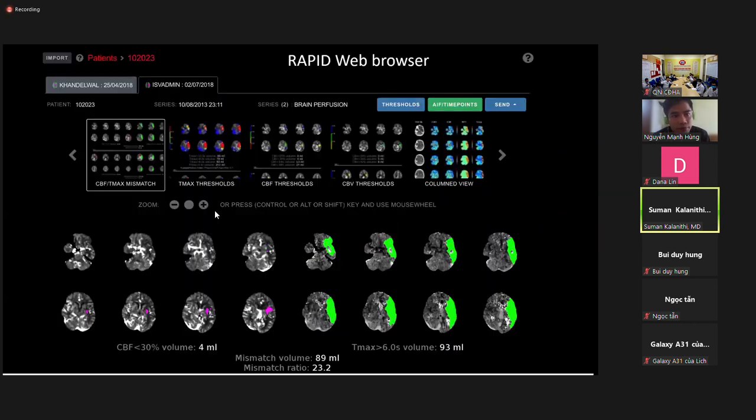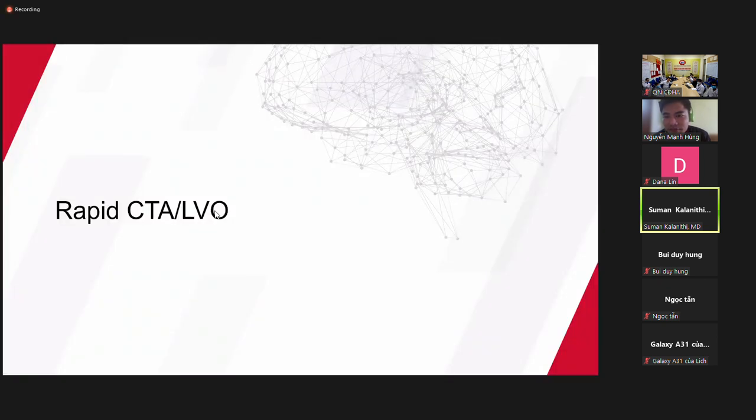That's actually basically it. I just wanted to show you some of the things that can be confusing about Rapid, but they're not that many, and you guys are very smart and sophisticated, so I think you'll get that. Those are the few things where people can get a little bit confused, but that's it.